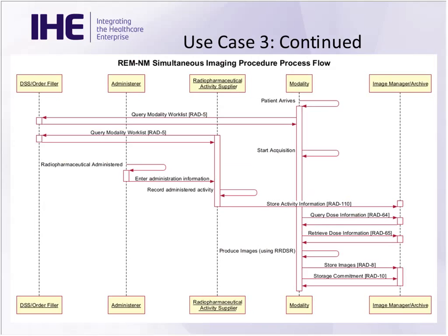I'll just skip down to, you'll note that the modality is querying, I guess at the top, the work list, and also the RAS is querying the work list. And the start of the acquisition and the administration of the radiopharmaceutical are very close to the same time.